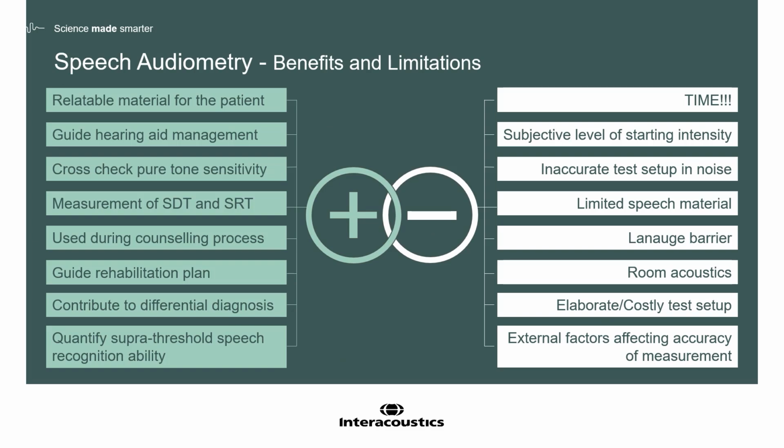Speech audiometry is something that clinicians perform at times to supplement audiometry. Performing these tests provides the clinician with more information, and we can see and understand some of the reasons why speech audiometry is beneficial. It certainly has its place, and there are lots of studies to suggest speech and noise tests specifically can help supplement the patient rehabilitation process. Additionally, speech audiometry provides relatable material for the patient. It can help guide hearing aid management. It can be used during the counseling process, and more.